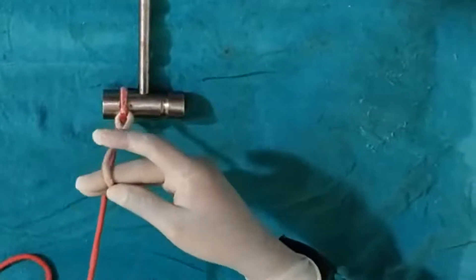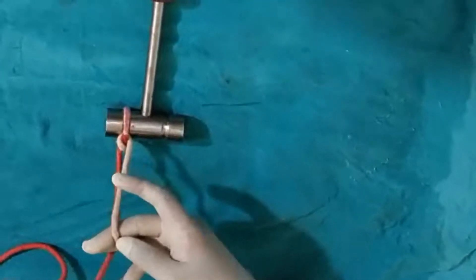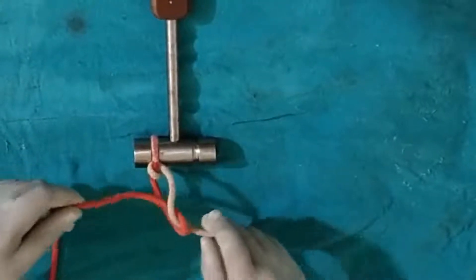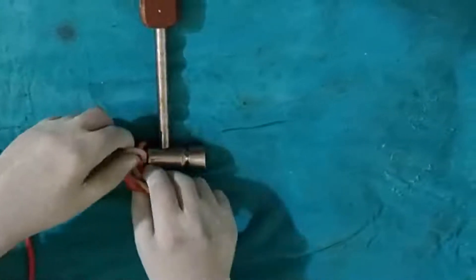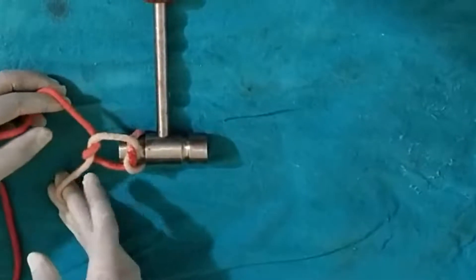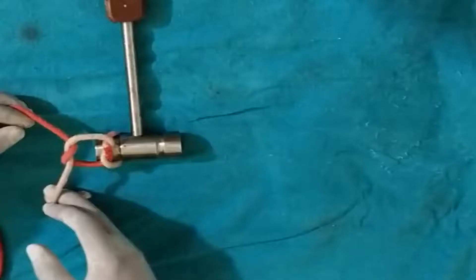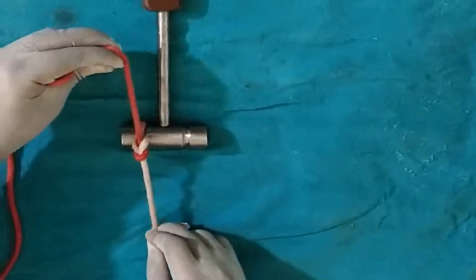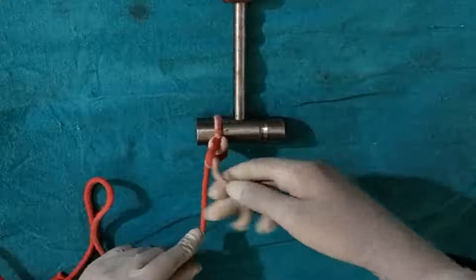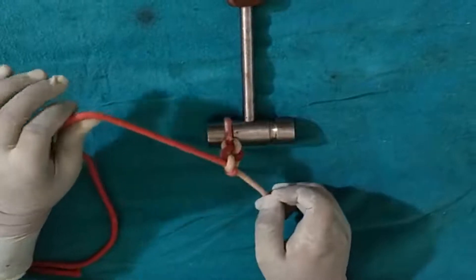For the second throw, you just move and keep it like this — put it from the outer side and then hold with this one. You can see here this is the square knot because the throws are parallel to each other. If the throws are crosswise, then that is the granny knot. You can put the third one again from the corner of the first, like this. In this way you can apply the one-hand tie.